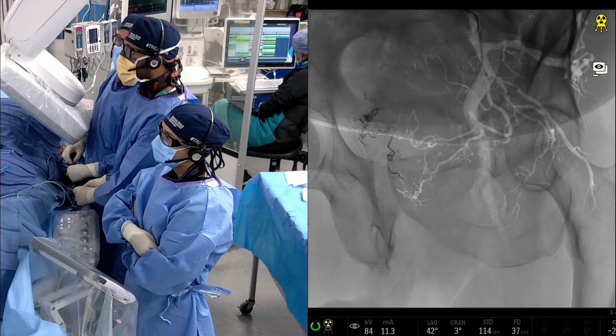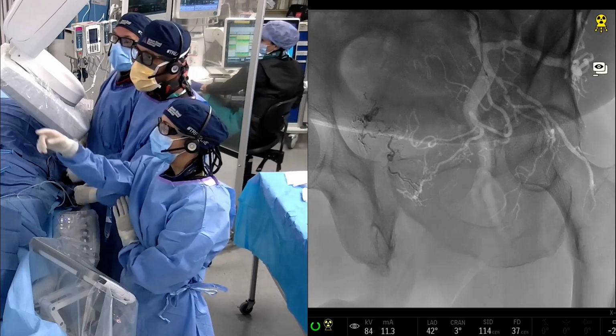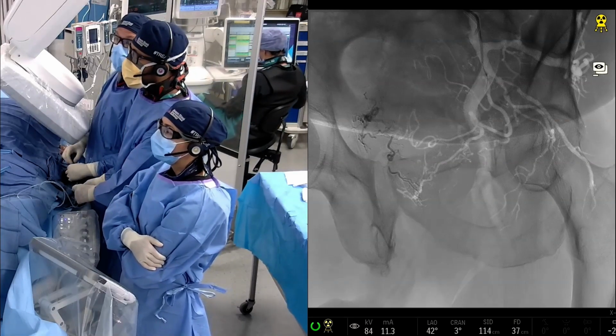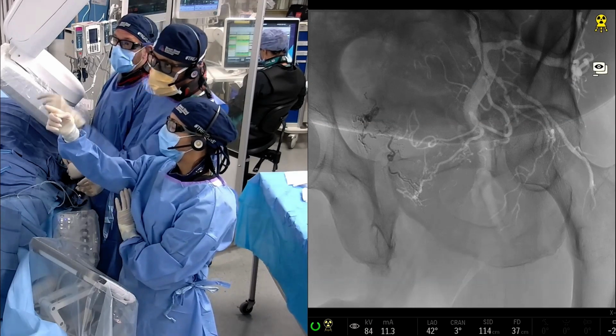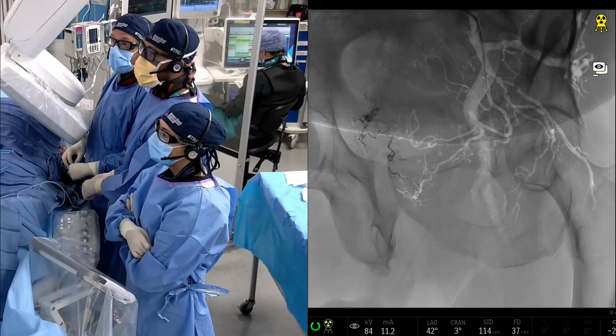How's that catheter performing? It might be a different, separate origin. It feels fine. You've used glue, I think. The key thing is to get it out and flush it quickly. With a 10-to-1 concentration, you have the ability to do that. But you can't leave it in for 30 seconds and then expect to be able to flush through it. Right, it might be doing like a tight loop. There you go. There we go.